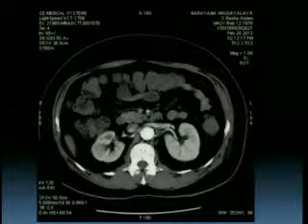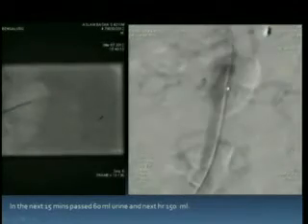And when I go down, next one, what you see is the right renal artery, but that right renal artery actually supplies a kidney which is non-functional, and this is the left renal artery. So what has happened here is that I have gone from the true lumen, possibly through a re-entry point, and accessed the left renal artery, which is a bifurcating branch. Initially I thought I should do a fenestration, but that didn't work. So I decided to bridge this using a plain stent. And this is the plain stent which we have put in. And you will see here, the stent is actually bridging across. There is a flap there, true lumen to false lumen.